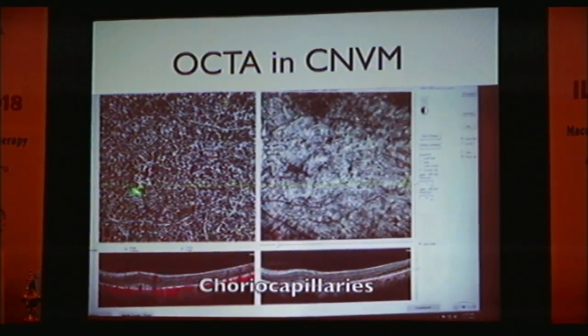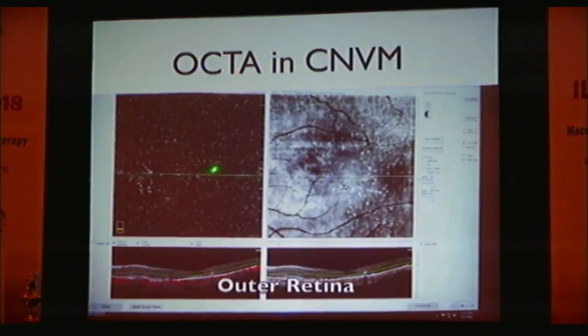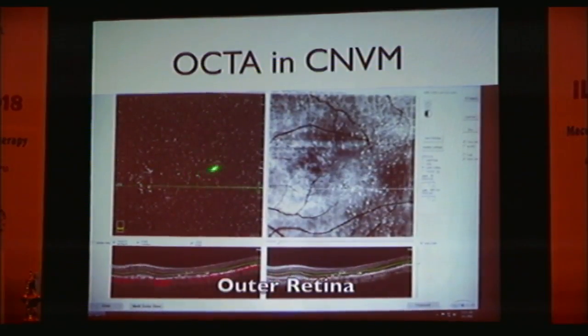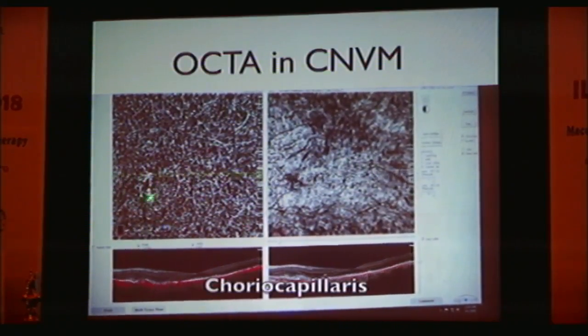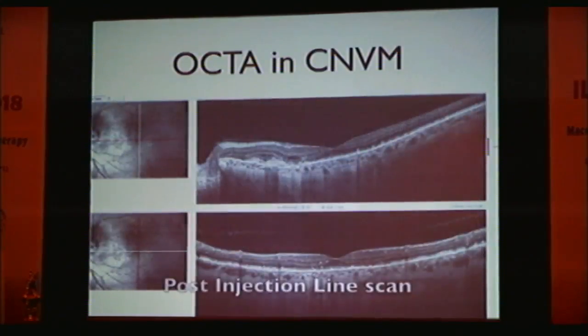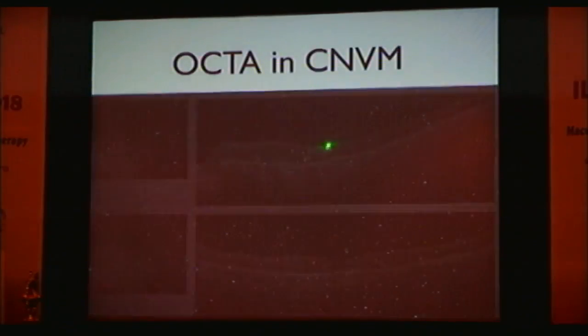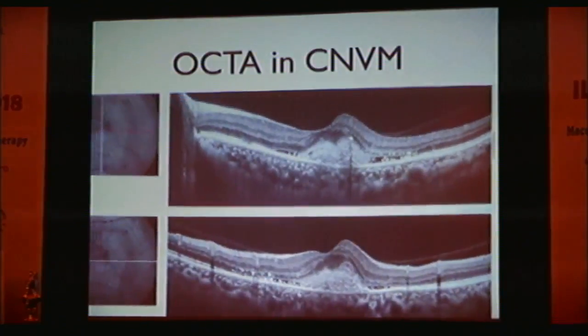Now when you have these mature vessels, even after doing your treatment, I have just given one injection of Eylea, and when we did the OCT scan again, in the center the vessels had disappeared, but these mature vessels remain more visible, and they are the ones that might again extend over to the center. So this is how it is when the macular area is better.